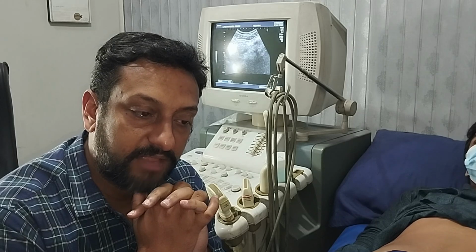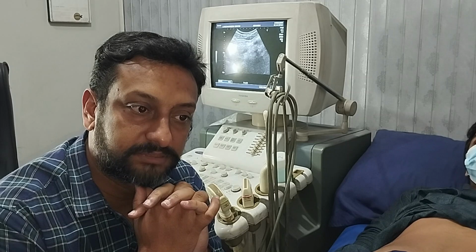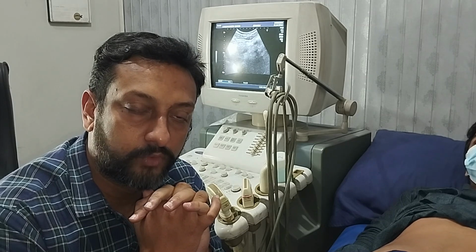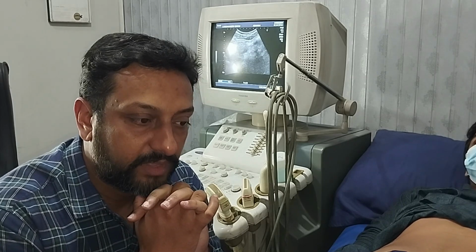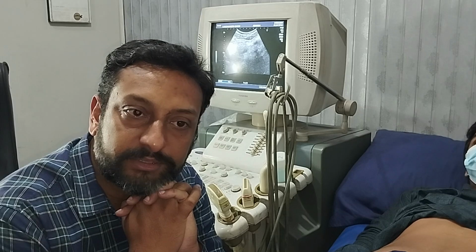Secondly, I recommend that we do this pancreatic scan when the patient has taken some fluid. It is necessary. However, most of the time in cases of chronic pancreatitis and acute pancreatitis, the patient is NPO.